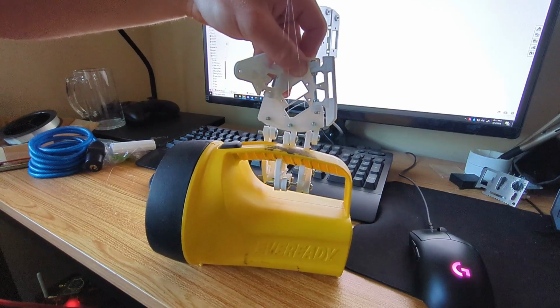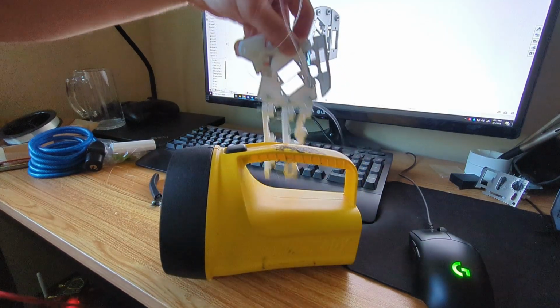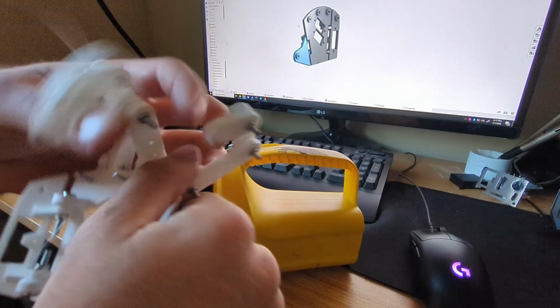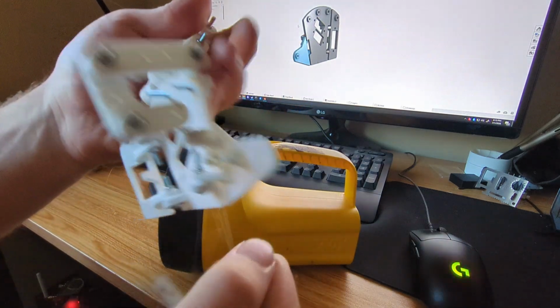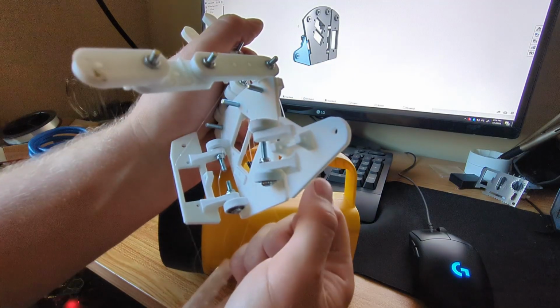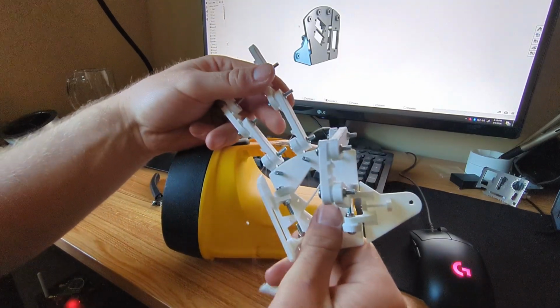So next steps is probably going to be build a test stand where I can hook servos up to it and try actually actuating stuff automatically for poses, whatever, and more control, because currently there's a wire on the pull motion per finger and a wire on the opposite motion, the extend motion, and trying to orchestrate those for 5 fingers with just my hands is not gonna work. So getting the servos rigged up for that, where they can hold parts rigid, is gonna be fantastic.